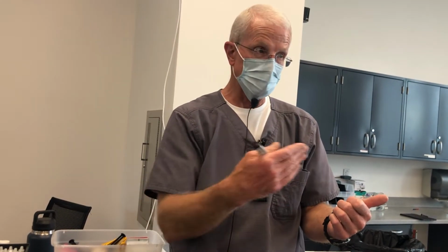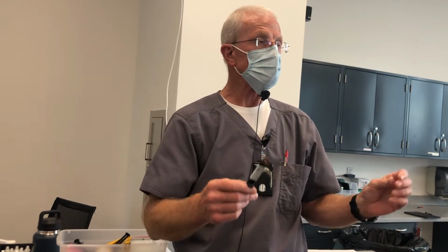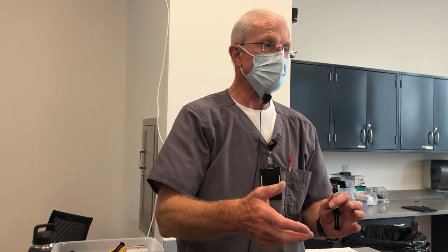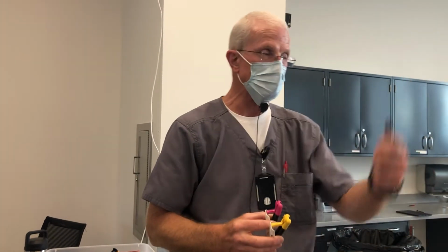That means they can be light activated, but once mixed, the chemical reaction will take place without the light. With every dual cure cement, and these are both dual cure, it's base and catalyst, mix it, insert it, it will set on its own, chemically. With every one of those, if you light cure too when you're all done, you will further polymerize the material and strengthen it. You can mix it and hit it with light and it hardens just like that.